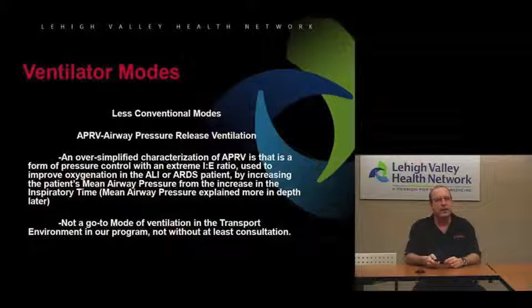The APRV, the airway pressure release ventilation. To really oversimplify that, and there's actually going to be a different presentation given by one of our other crew members on this, it's a form of pressure control ventilation with an extreme IE ratio, and it's used to improve oxygenation of an acute lung injury or your ARDS patients.